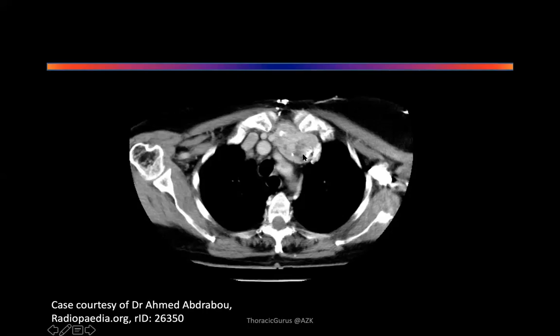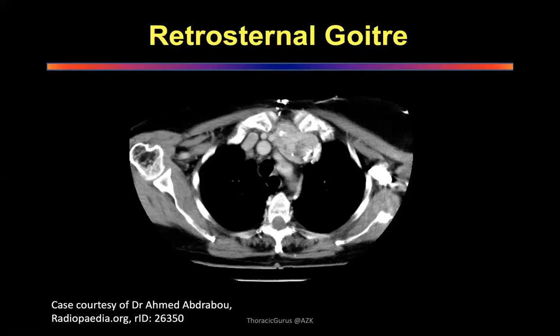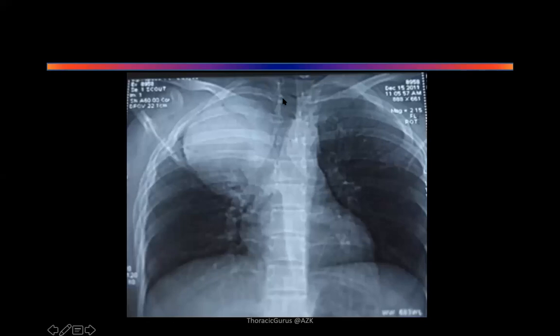Is the sternum normal? It is normal. There's nothing wrong with the sternum. This is just the section at the neck, lower down. Okay, quickly now. Come on, next to the Nikhil. You want to take this? Yes, sir.